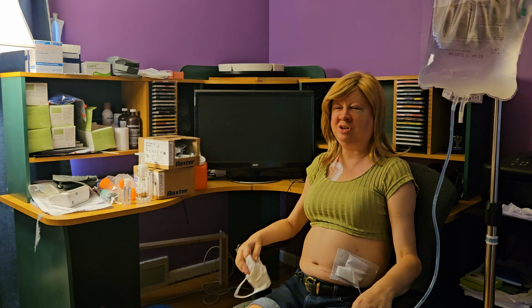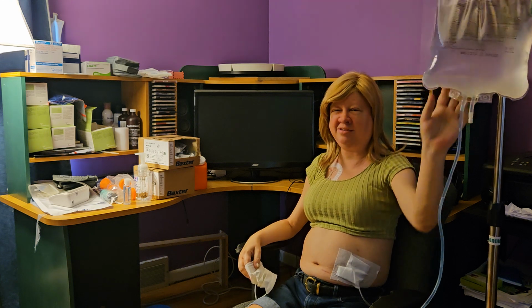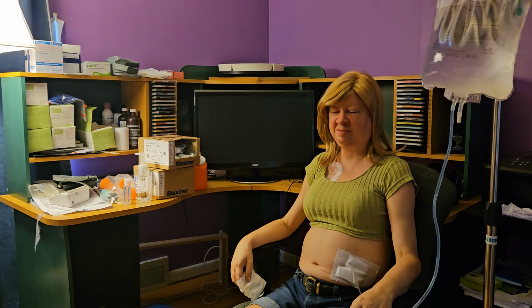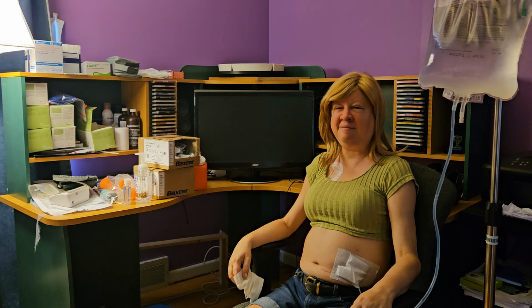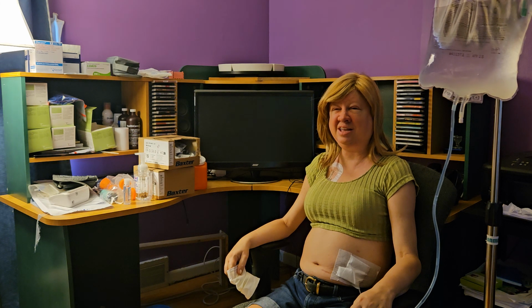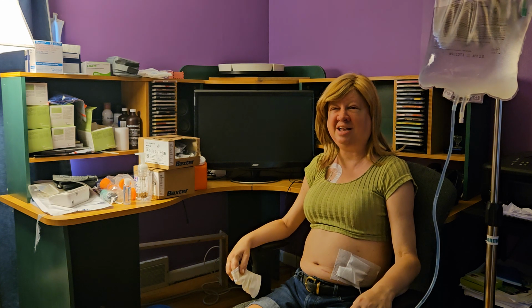You're supposed to drain all the fluid out and then weigh yourself and then fill it all back in with the bag. Usually around 8 a.m. and then noon, then around 4 in the afternoon, and then 8 o'clock at night. You do like a last fill, and then keep that last bag in me all night while I sleep. It can be up to like 12 to 16 hours before draining again next day.